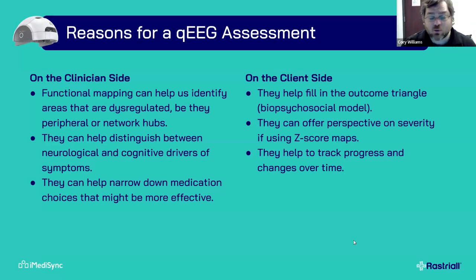The EEG is also a really useful tool for helping to guide medication choices. Now, it's never an exact one-to-one, oh, this EEG means this medication. It's not that simple, but it is a helpful tool in directing what type of medication choices we might think about. And again, a way to think about this is, is this a fast brain or a slow brain, right? And that can really help to parse down quickly what kind of medication might be most beneficial. For the clients, why clients like to have an EEG?